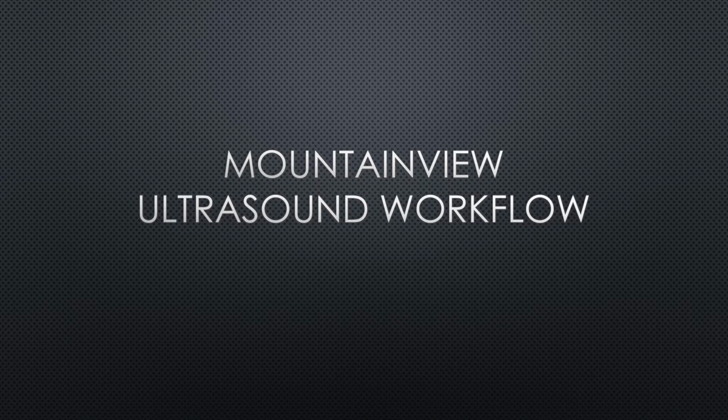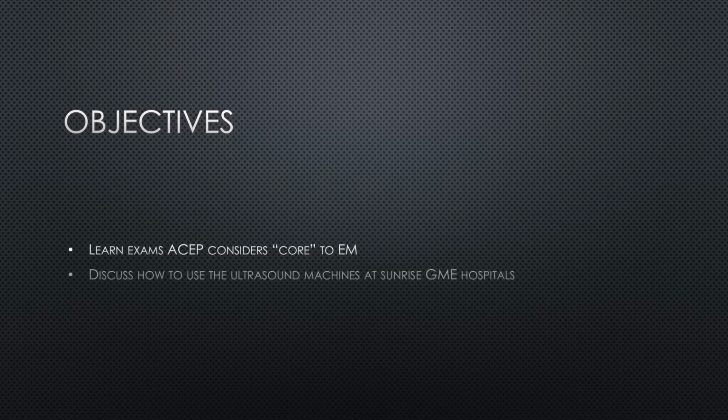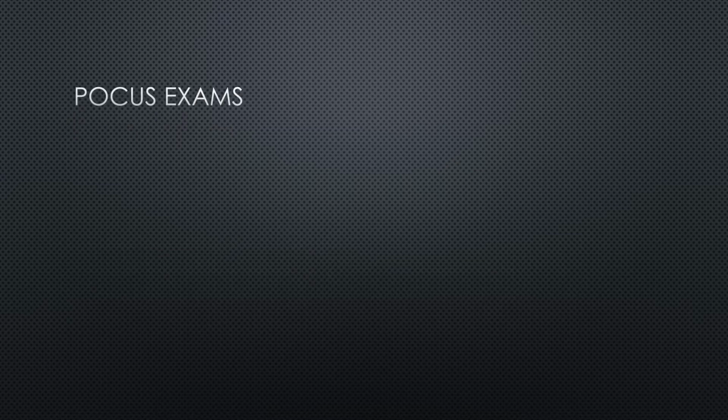So our objectives in this lecture: we're going to discuss what exams ACEP considers core, how to use the ultrasound machines at our hospital systems, and how to use QPath to save interpretations and review your feedback on your exams. So first, let's talk briefly about exams in general.